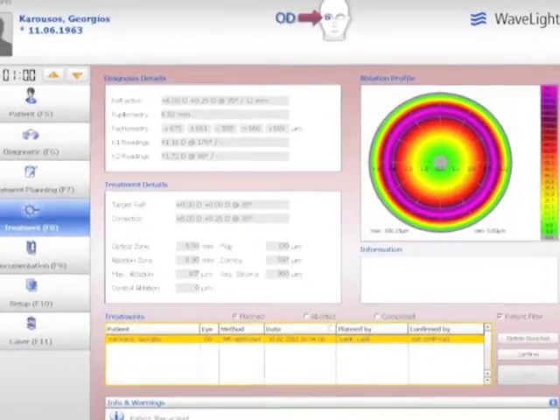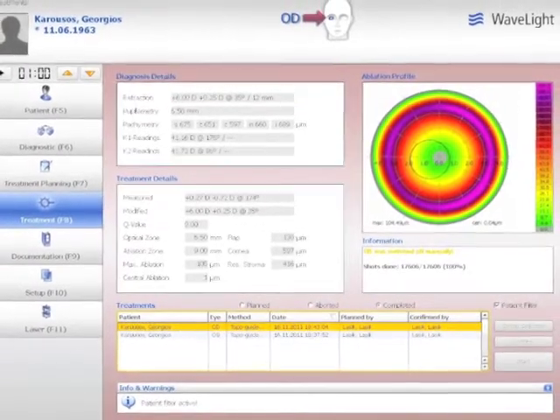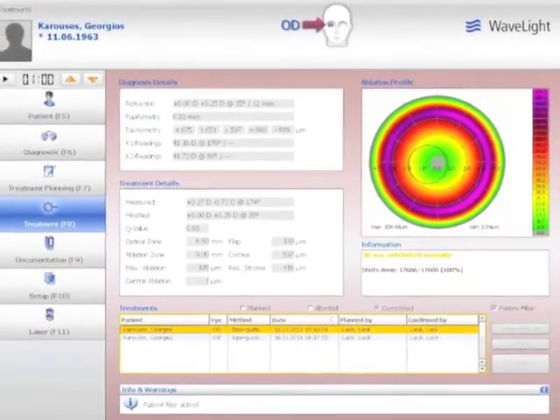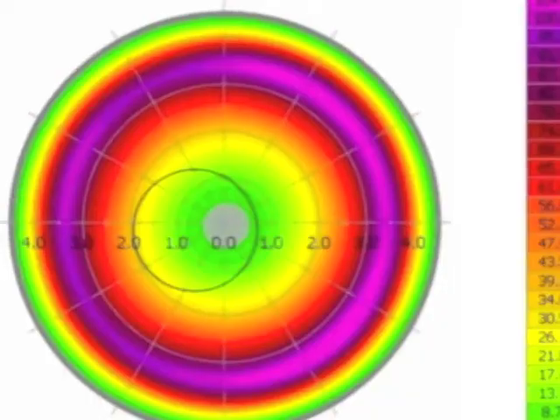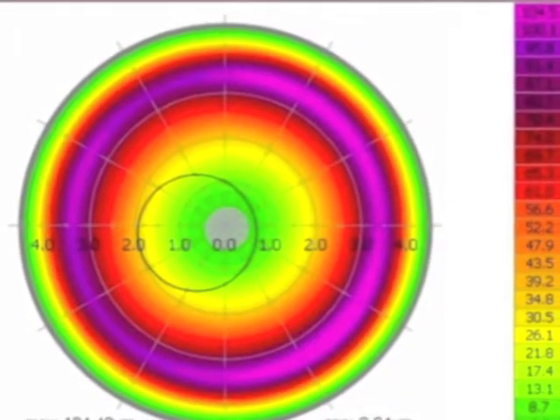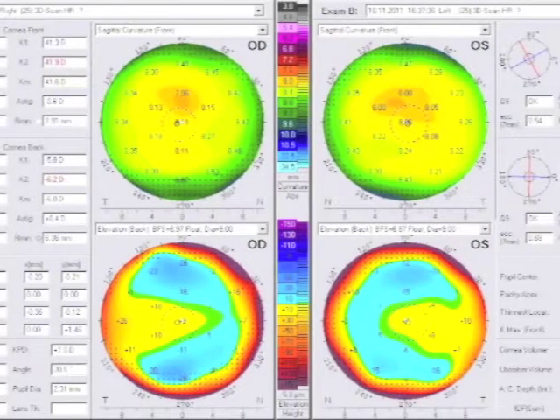You can see how the pupillary aperture, as captured by the topographer, will be in the center here. On the right eye, topography guided, you can clearly see the decentered placement of the ablation, and more clearly here, that it is centered on the visual axis of the patient. And again, we're going to the surgery video.